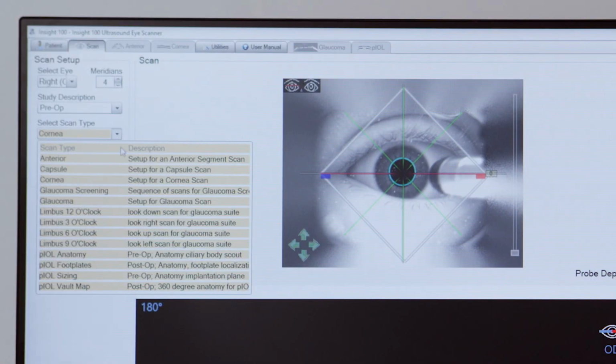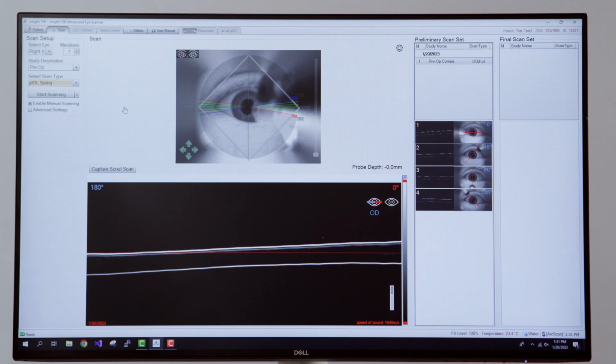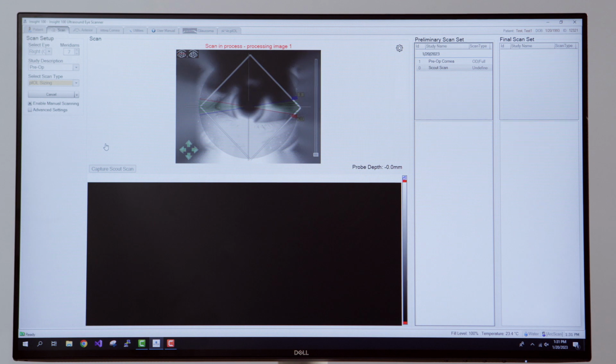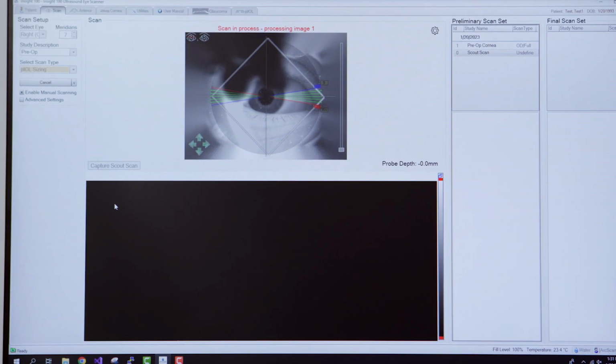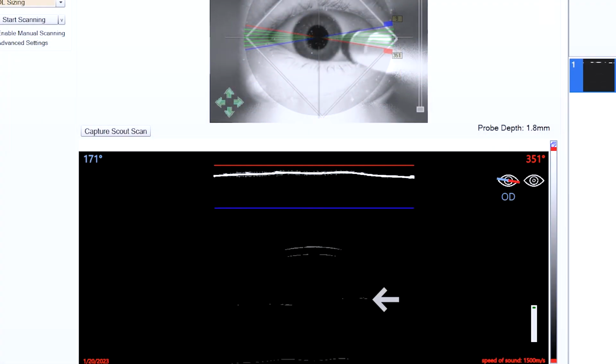Next is an example of manual scanning technique, choosing the phakic IOL pre-op scan type. Enable manual scanning by clicking this box. Center crosshairs on pupil by double-clicking on the center of the pupil. Click Scout Scan. Now the focal plane can be set manually. Simply click and drag this blue line to the desired focal depth. For a pre-op pIOL scan, start at or below the anterior capsule, which is represented here.